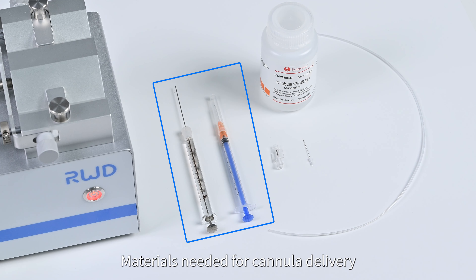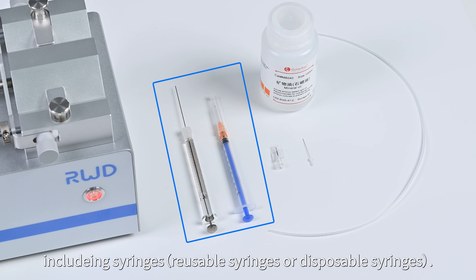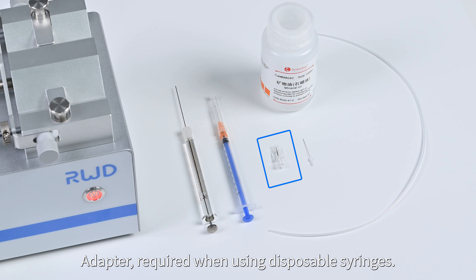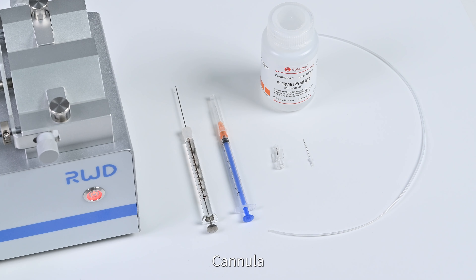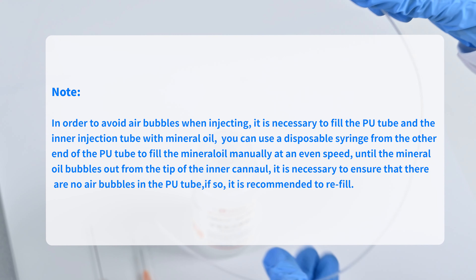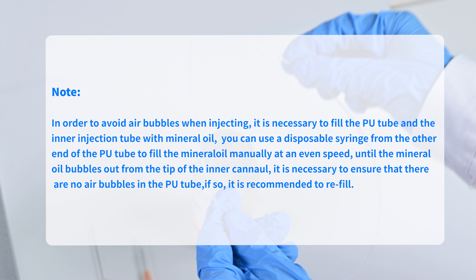Materials needed for cannula delivery include syringes (reusable or disposable), an adapter required when using disposable syringes, cannula, mineral oil, and PU tube. Connect the PU tube and internal cannula. To avoid air bubbles when injecting, fill the PU tube and inner injection tube with mineral oil using a disposable syringe from the other end at an even speed, until mineral oil flows out from the tip of the inner cannula. Ensure there are no air bubbles in the PU tube; if there are, it is recommended to refill.